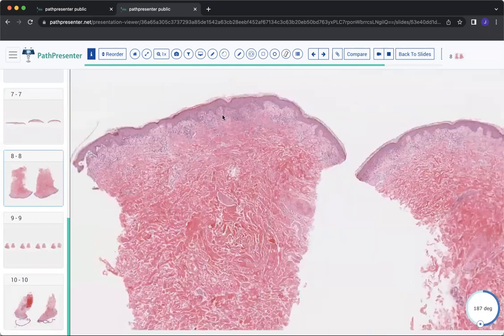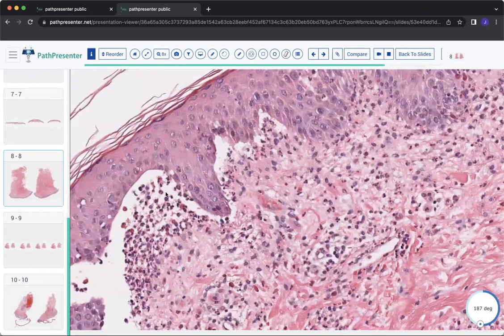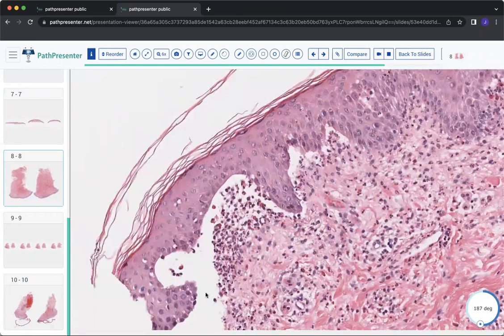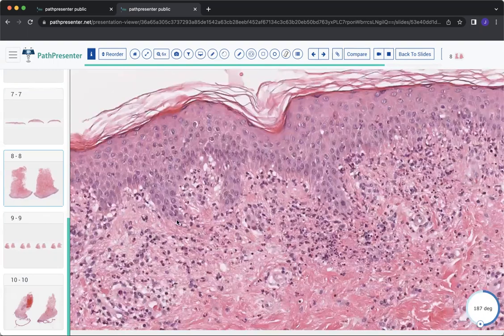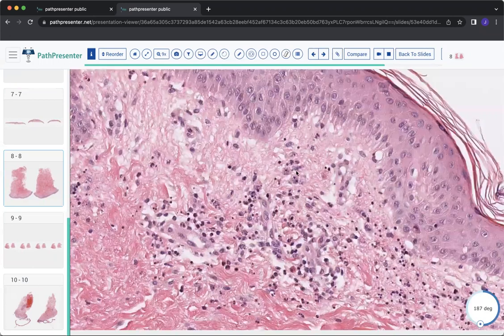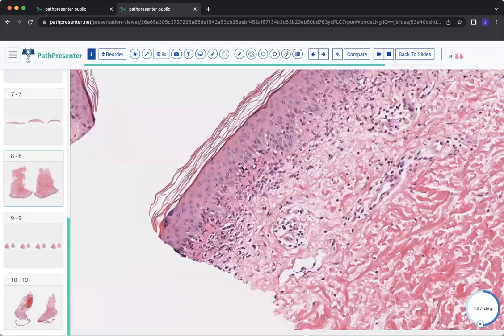And so this patient was given vancomycin and then shortly thereafter developed large bulla here. And you can see these kind of pseudo neutrophilic microabscesses. Actually, they are neutrophilic microabscesses in a way, but it's more contiguous in terms of the way that the skin is lifting off here. So in some sections, it's pretty indistinguishable from dermatitis herpetiformis, but I hope you can appreciate how confluent the neutrophilic inflammation is along the dermal epidermal junction. And if you were to do a DIF on this, you would find a linear IgA pattern. And so that's your diagnosis, linear IgA bullous dermatosis.